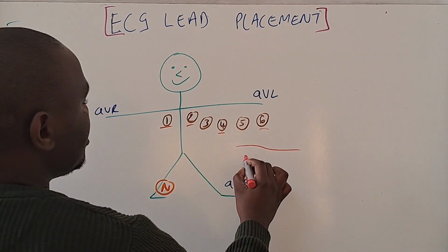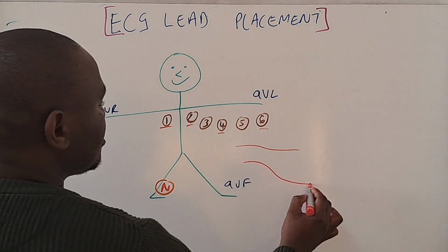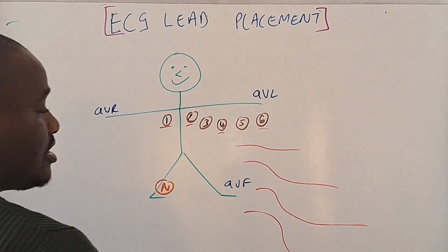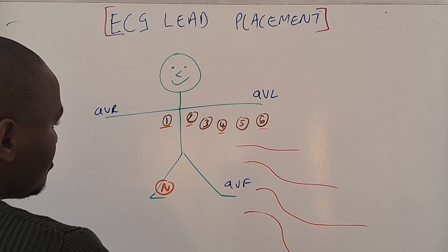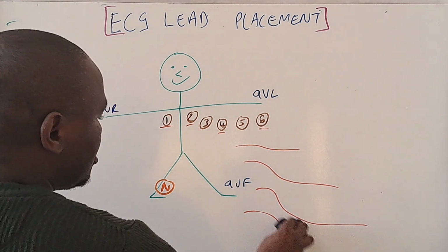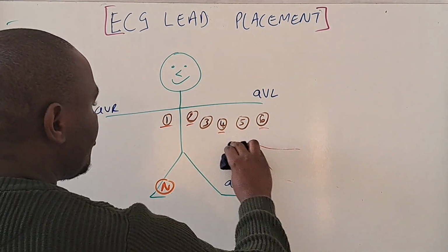The minute your ECG electrodes do this, or do that, then you know that you have not placed them correctly. They just make a nice depression there that almost looks like it's not there, but it's there. Then you know that you've put them nicely.